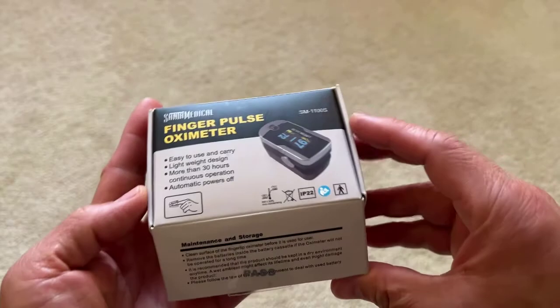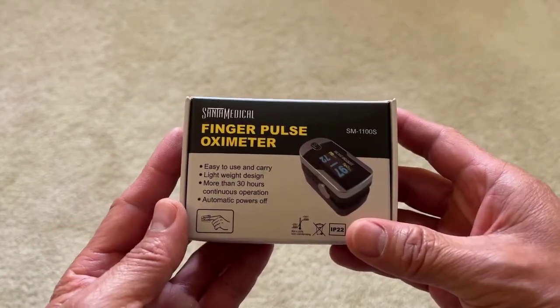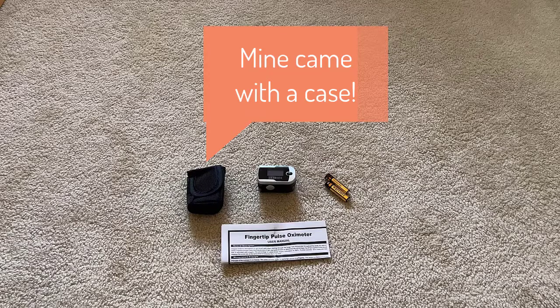It's tiny, making it easy to carry and very portable. It works on two AAA batteries and comes with a neck or wrist strap to easily carry around.